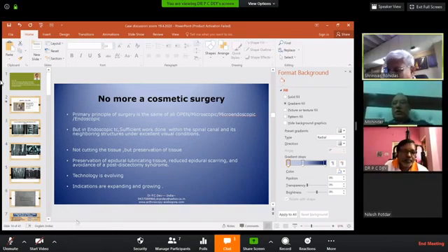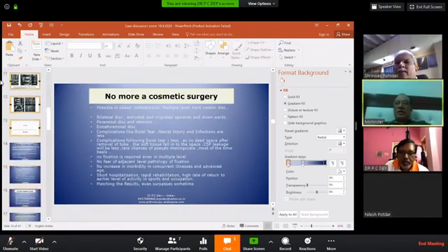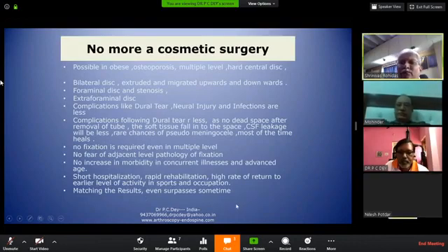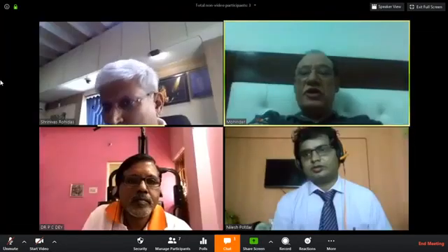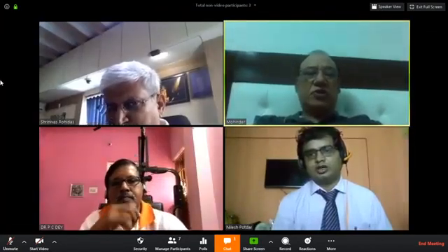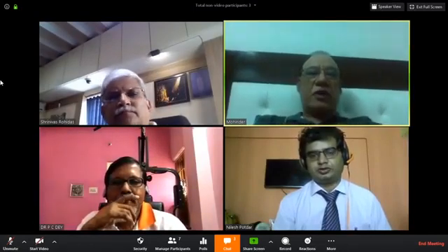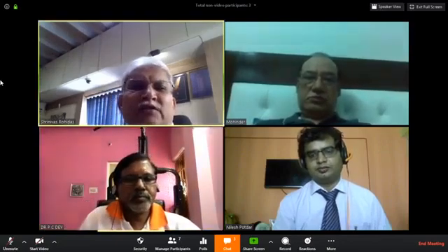Okay. No, I think his question is, can you use RF blade? RF is the same Arthrocare which we use in arthroscopy. So in the Destandau, no, we cannot use RF because it needs fluid medium. Yeah, you have a special endoscopic microbipolar cautery. I think PC probably didn't show that, or in some of the video, if you can show that tip of the microbipolar. So we'll go to the question answers now.